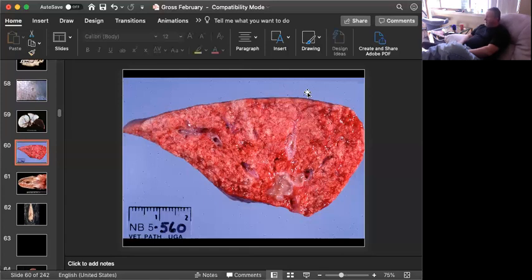If your mom ever used a piece of pumice stone, which is like lava rock, to smoothen her feet. Or if you've ever put these in your barbecue, your propane tank, it's like lava rock. This would be very fine. If you crushed it, it would sort of crinkle up. It's a tough slide to look at the first time and get it right.